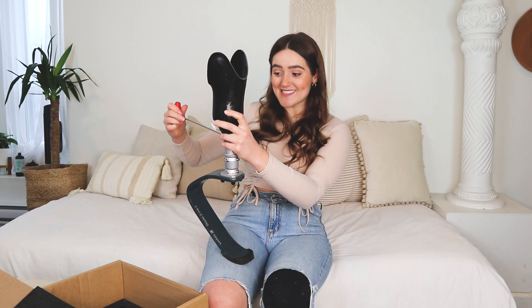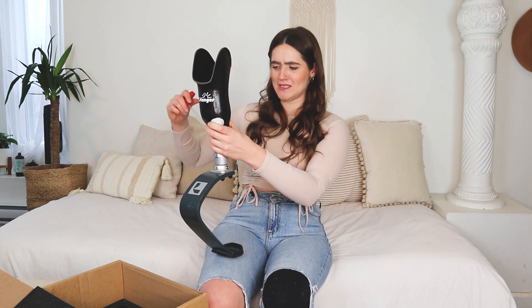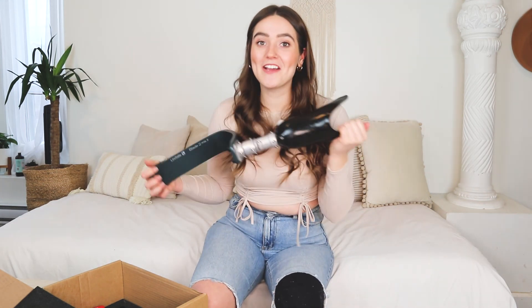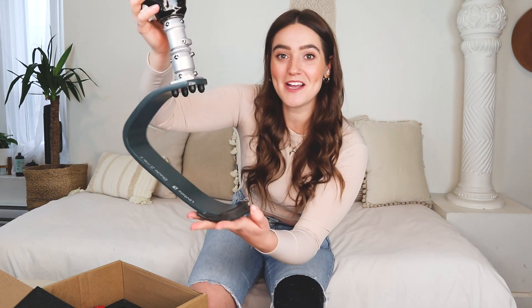I can't wait to call my prosthetist and be like, guess what I did — I also built the leg! Voila, there is the final piece. Now I can run, now I can do all these sports, and I'm so excited that I built this all on my own. Ciao for now!